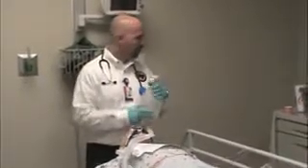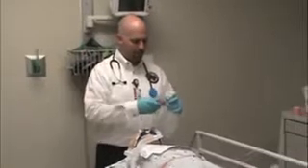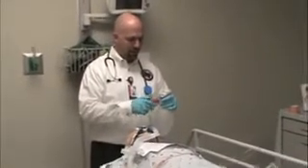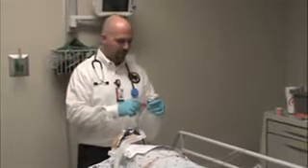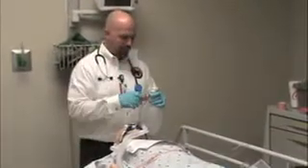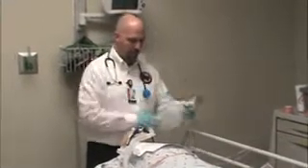A standard bag valve mask usually will have a cap that will pop off the top and allow us to put a PEEP valve on, and we can measure that amount of PEEP by the coil tension on the spring. So for physiologically stable patients, we're going to have a PEEP of 5. If they have sick lungs, we'll sometimes dial up to a PEEP of about 10. If you exceed a PEEP of 10, I would make sure you're really, really carefully watching their blood pressure. But always have a PEEP valve available.